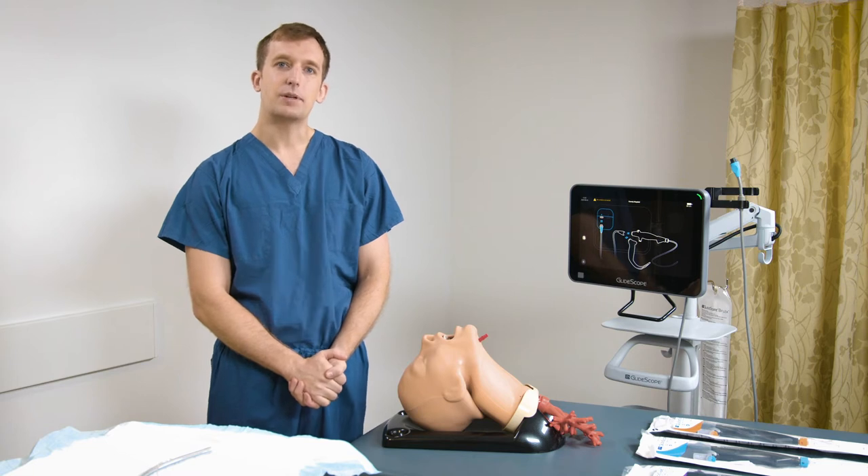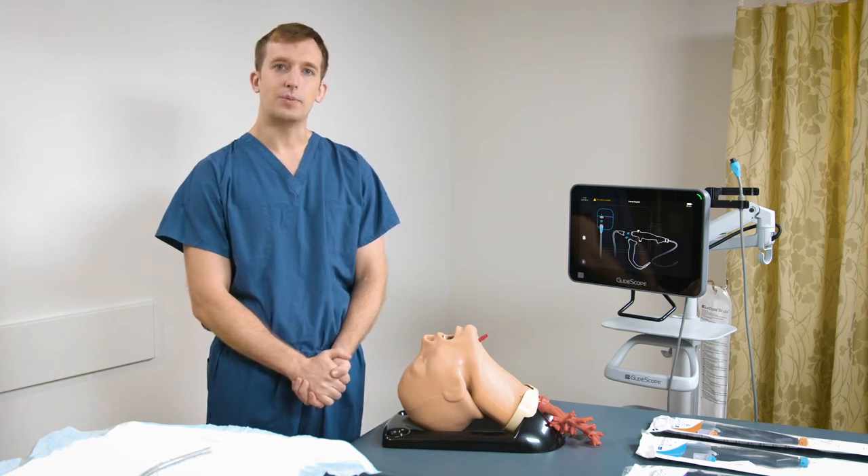Hi, I'm Dr. Raynor. Today I'm going to be talking about performing endotracheal tube intubation using a B-Flex single-use bronchoscope.